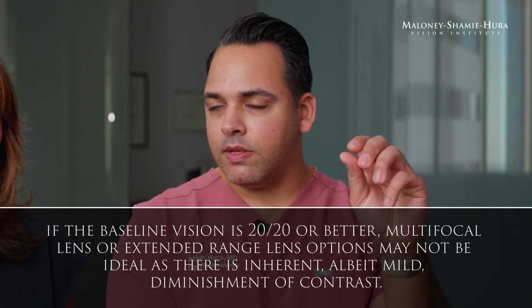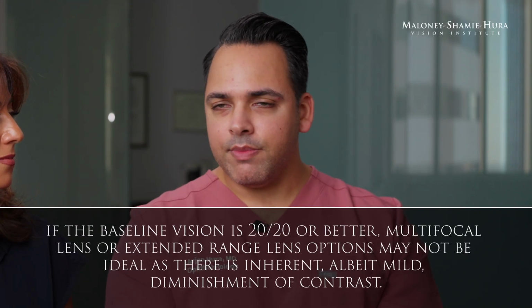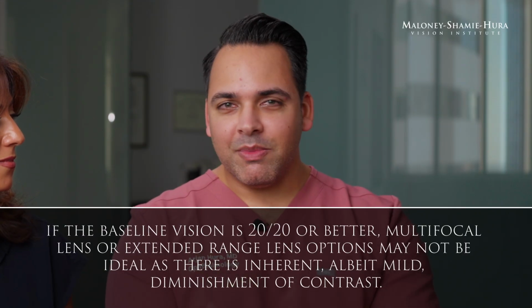That's a patient, maybe an emmetropic presbyope, for example. We use a multifocal and they were best corrected to 20/15. They're out of glasses, but now they're like, gosh, I feel like my distance vision was better before surgery. And that's a situation we want to avoid. And so if I see that a patient's 20/15 or 20/20 best corrected, I'll have a long conversation with them about what are your desires and how bad do you really want the range of vision at the expense maybe of a little visual acuity. With cataract patients, it's not a big deal because their best corrected visual acuity has dropped, so that's not really something we have to worry about. But for those patients, those emmetropic presbyopes, 20/15, 20/20, that's another thing worth considering.